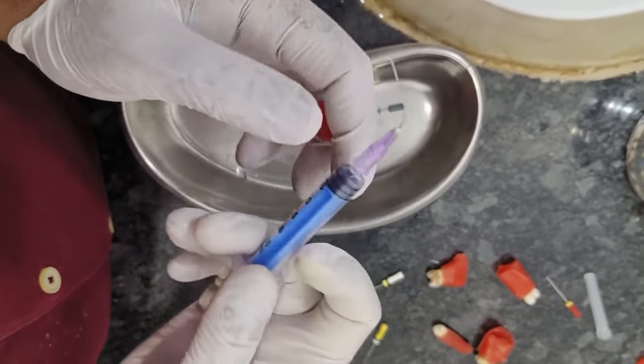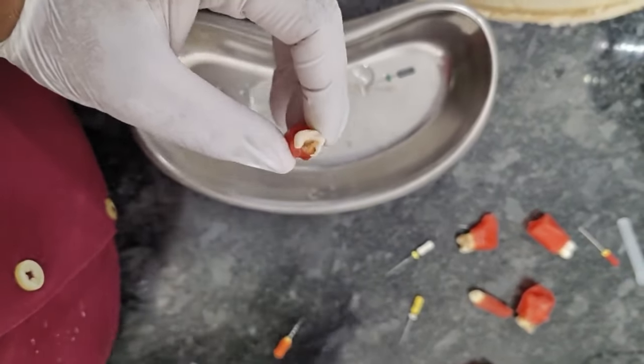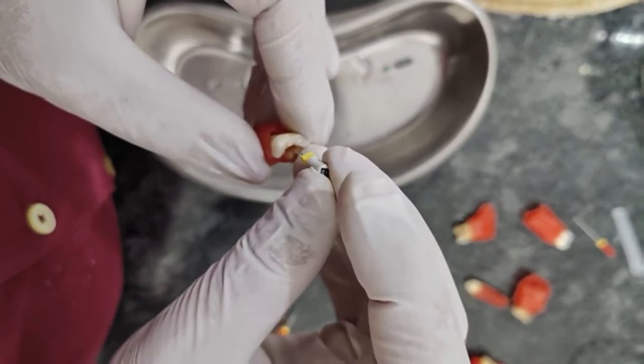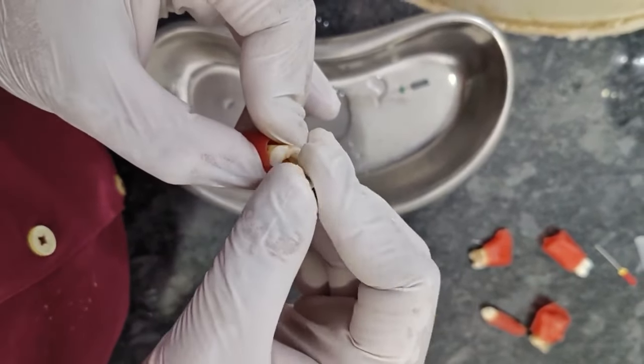So irrigation is very important. Again, insert the number 15 file. This is the K file number 15. And we have to do the BMP nicely so that the number 20 file goes inside.